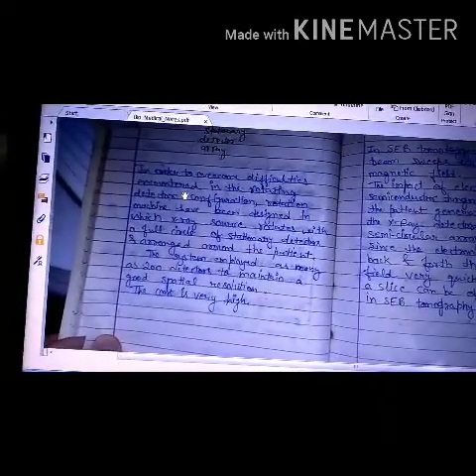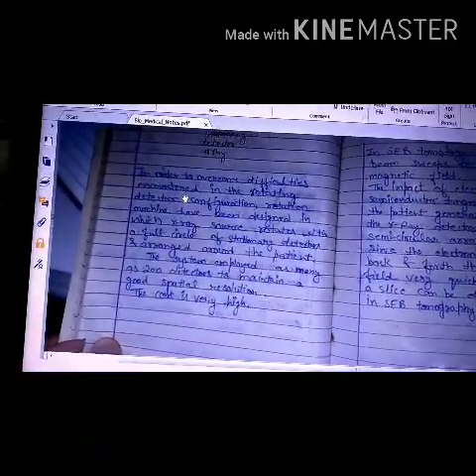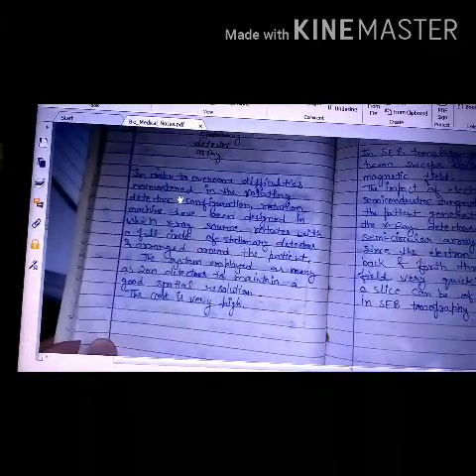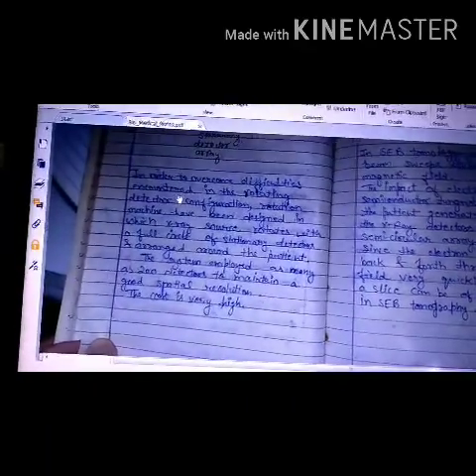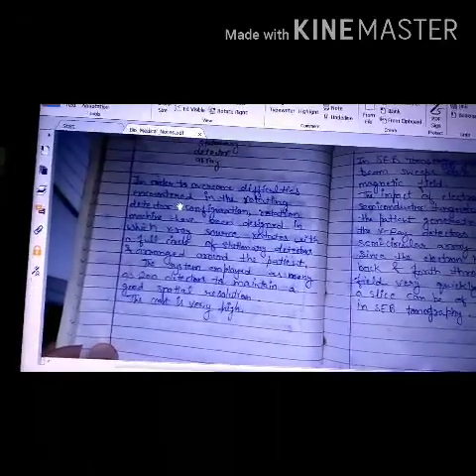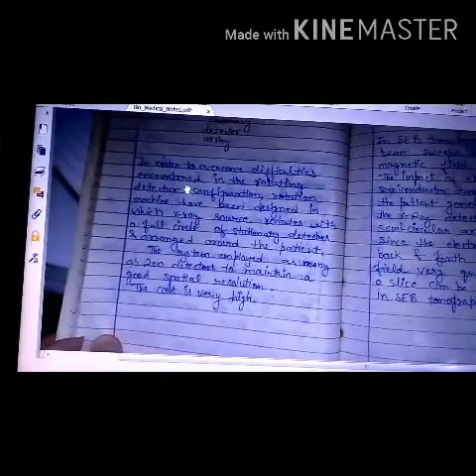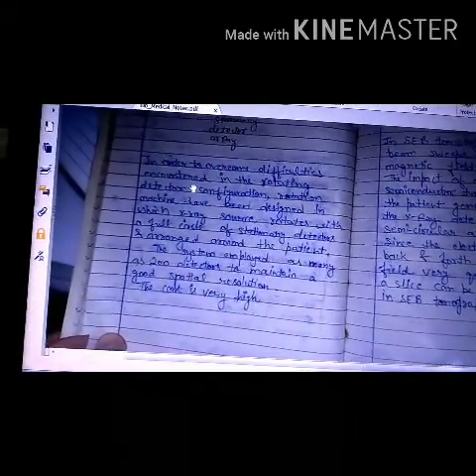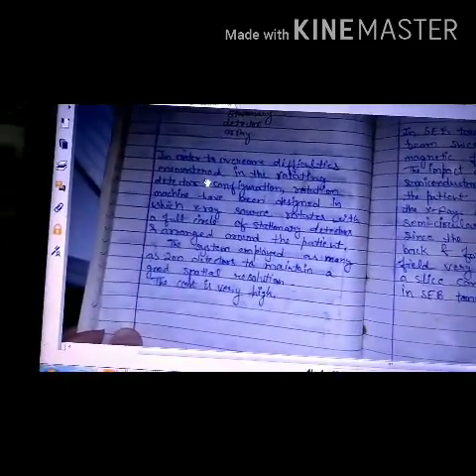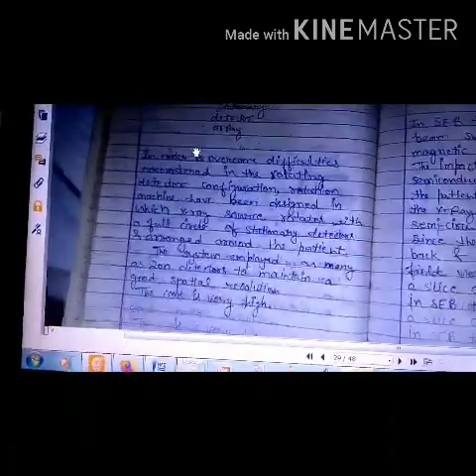The detectors completely cover or encircle the patient in all 360 degree directions, and the X-ray producing fan source is rotated throughout the patient. So in each direction as the source is rotated, the opposite detectors observe and gather the information, which then produces the complete image. The system employed as many as 200 detectors to maintain a good spatial resolution. However, the cost of such a system is very high, as the detectors and their materials are very expensive.